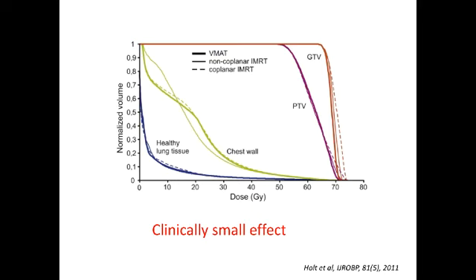Clinically, however, this is a relatively small effect. Here are the DVHs from these 3 plans for lung tissue, and it's kind of hard to appreciate the differences. So it's unclear that you can say any one is better than the other.